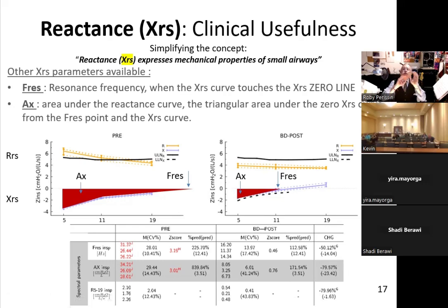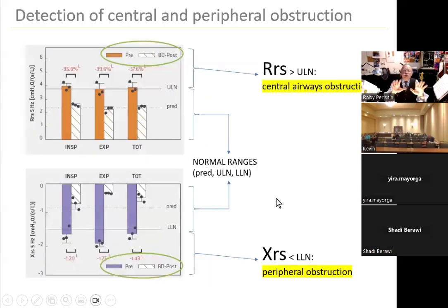This technology works on small and large airways, but it's the dream come true for looking at the small airways, which in pediatrics and in asthma is one of the wishes of everyone. So the only thing you have to change a little bit from the spirometry we've done for many years is the way to look at it. So resistance and reactance: at the end of the test, pre and post bronchodilator, you will see how the post changed. And the same thing is for reactance.